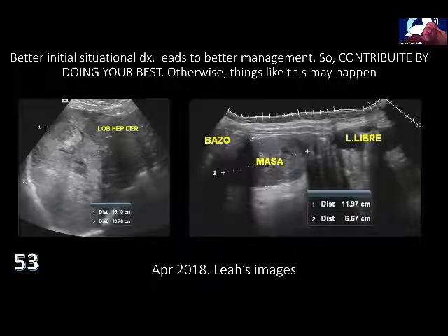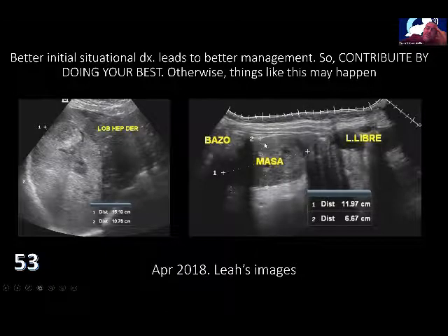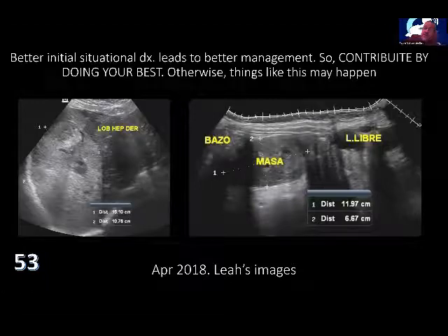And eventually she comes back with liver metastasis, some complex masses below the spleen, free fluid, the whole scope of an ovarian malignancy in a 19-year-old, nice looking, and wasted life.